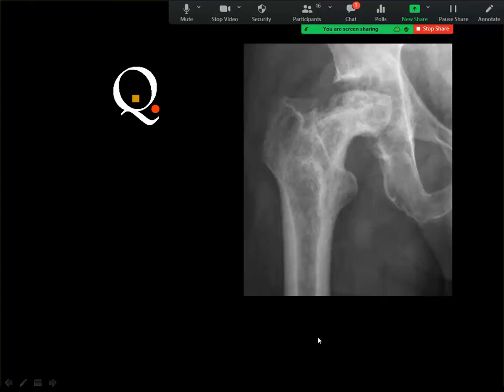No? Other possibilities? Perthes disease. No. There are three participants who would like to answer.